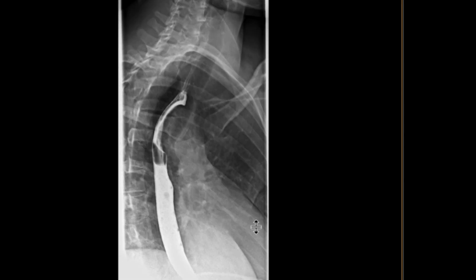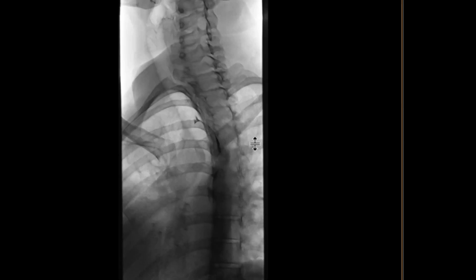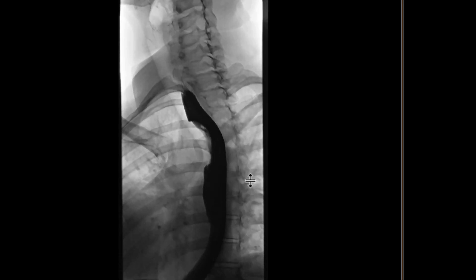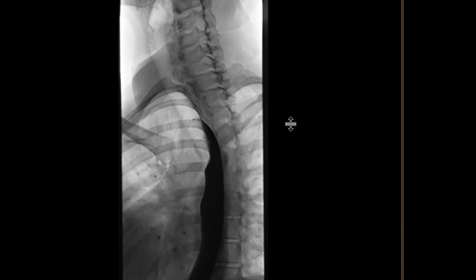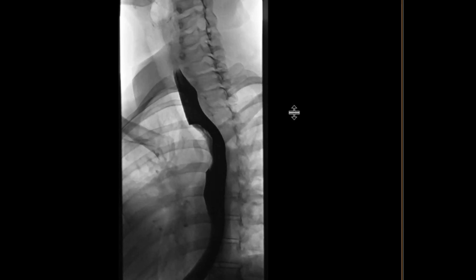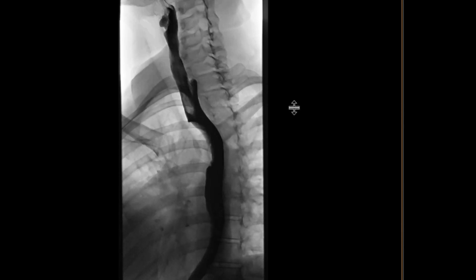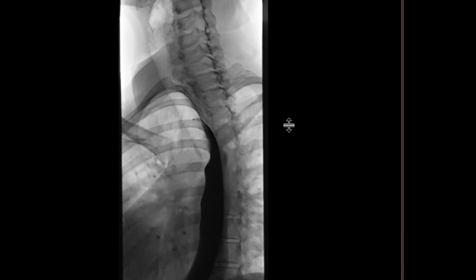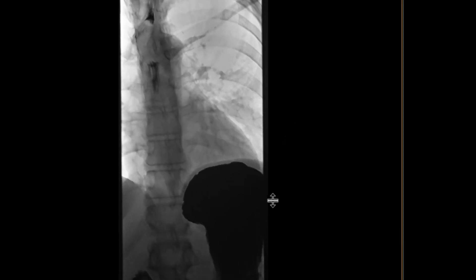You can see that it's persisting on multiple swallows, and we can see it persisting on multiple positions. You can see it beautifully here — very smooth border — so not really worried about an underlying adenocarcinoma or squamous cell cancer because of the smooth borders. It really does look like it's arising outside of the esophagus or potentially within the esophageal wall itself.